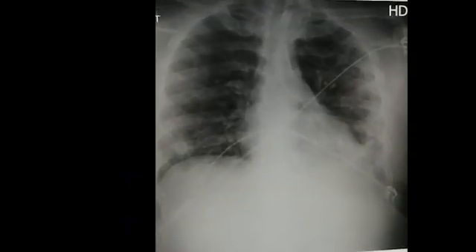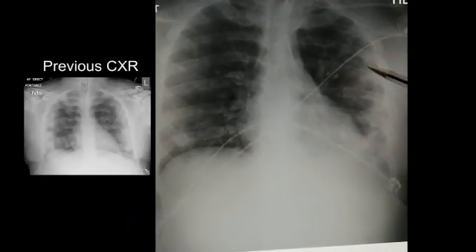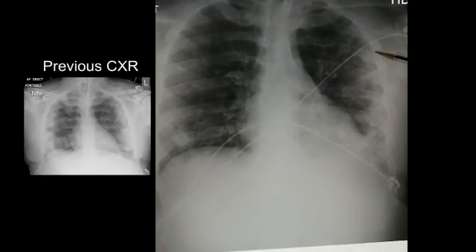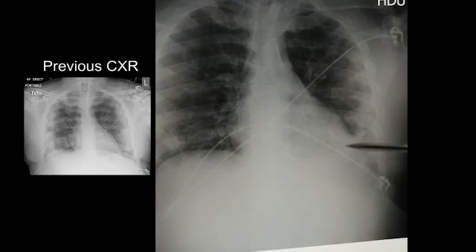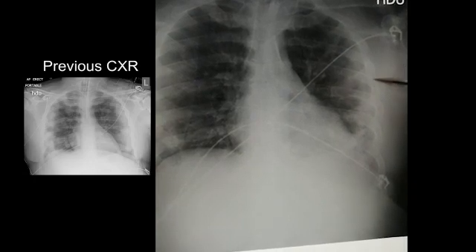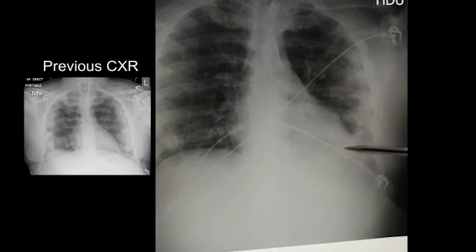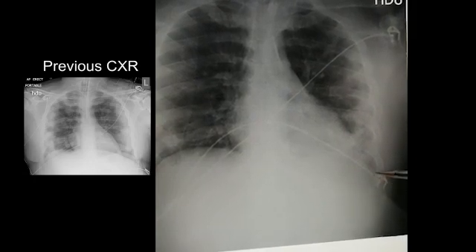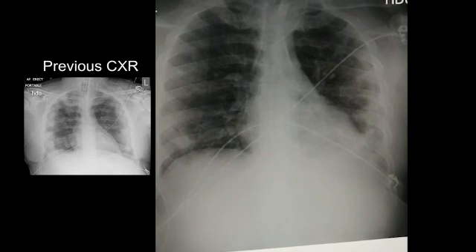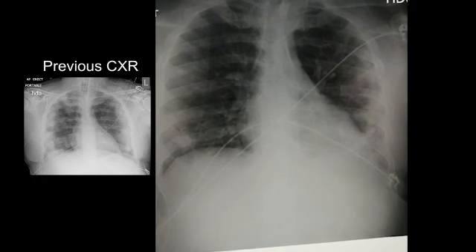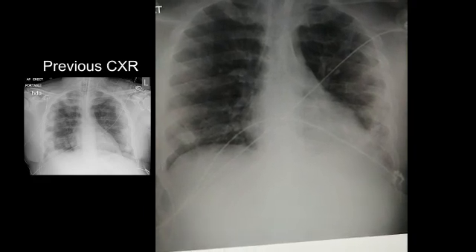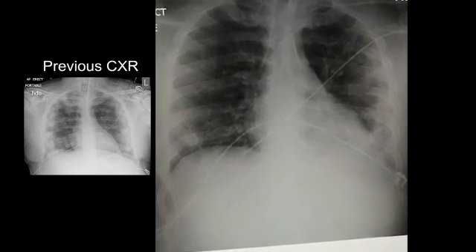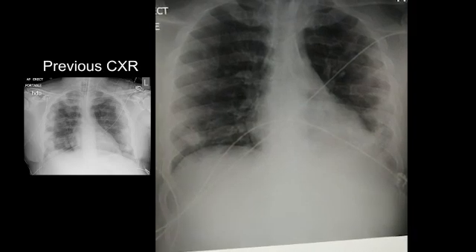This is a few days later, and thankfully this is a good story — the patient is now much better. You can see that the peripheral patchy consolidation is much improved from before. This patient is now off HDU, has made a full recovery, and we're going to hopefully see this time and time again.